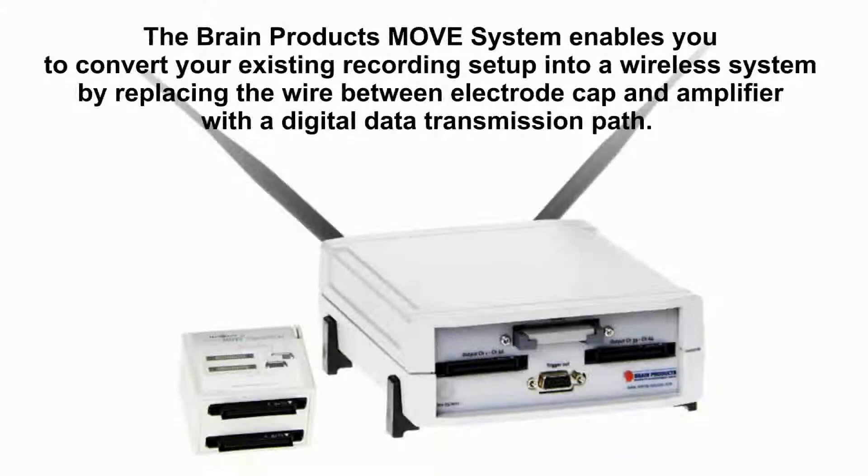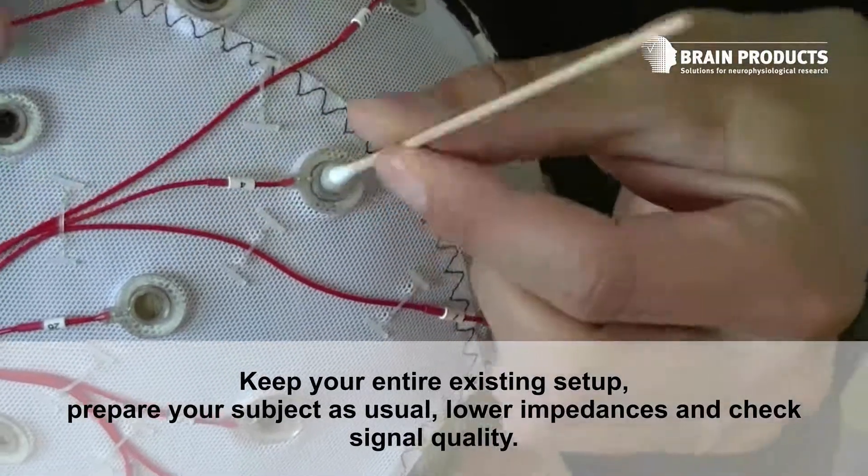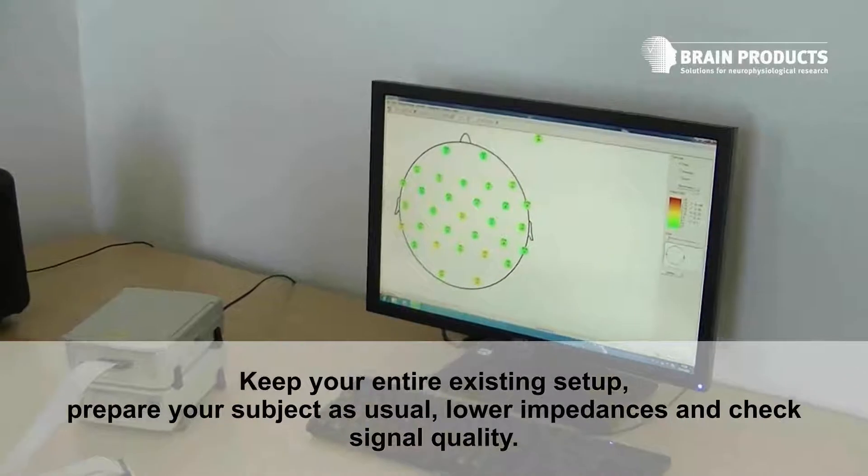The Brain Products MOVE system enables you to convert your existing recording setup into a wireless system by replacing the wire between electrode cap and amplifier with digital data transmission. Keep your entire existing setup and prepare your subject as usual.